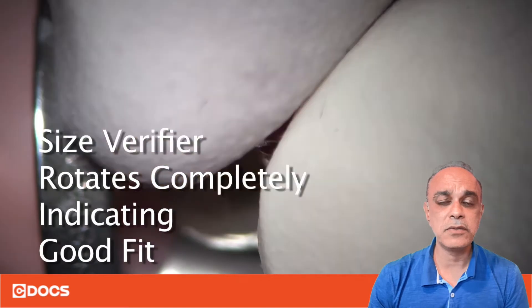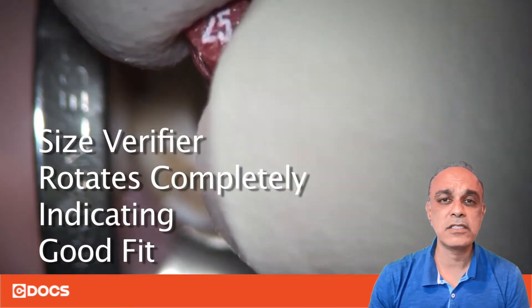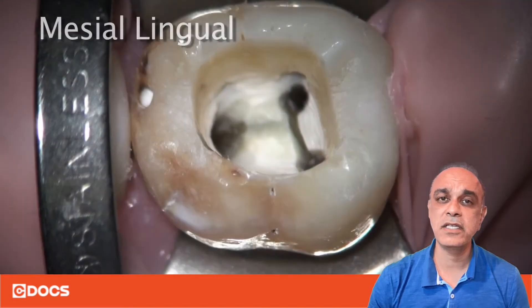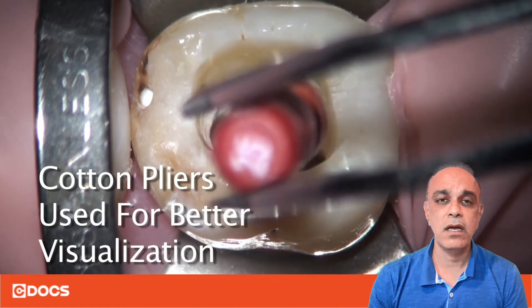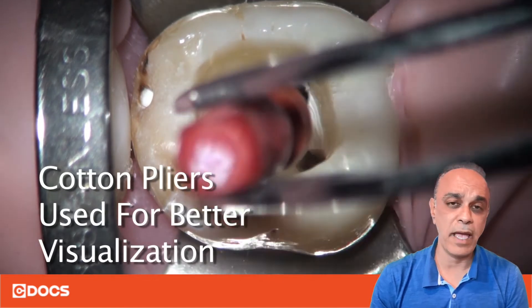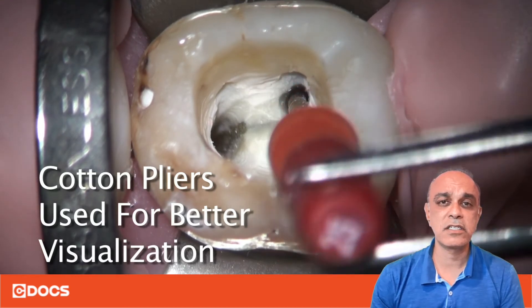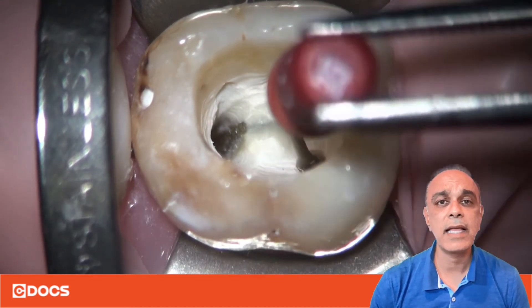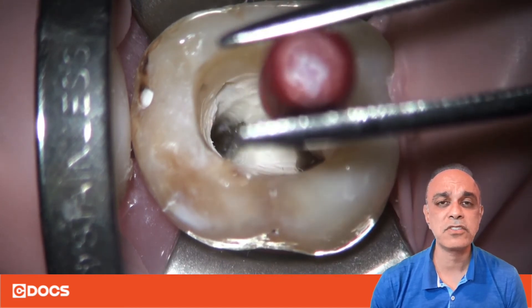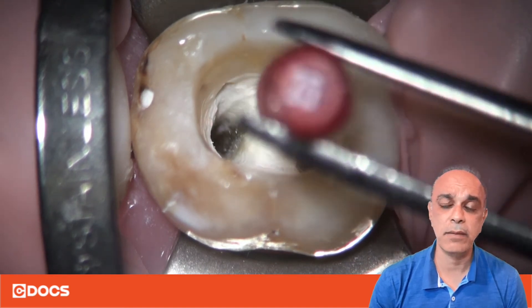The first thing I'm going to do is grab a size verifier and take it to working length and spin it 360 degrees. Take a look at this video — you'll see that I'm taking it to working length, using my apex locator to make sure I'm at working length, and then spinning it 360 degrees to make sure it doesn't slip past working length. That means I am clean at the apex and I've created an apical stop so that my carrier will go to that point only and not beyond.